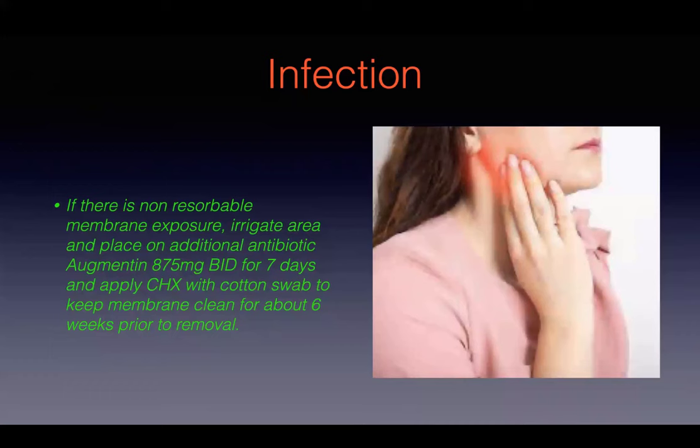And then once it's completed, I'll do the flap. And then I really just get the end of a periosteal elevator and just pop them out. You just have to be careful though, because the last thing you want is that going to the back of the throat and the patient swallowing. So you want to pack a throat pack on there, 4x4, and really just be extra careful with that. I do let the osteoblasts just take care of restoring the defect there. Yes.